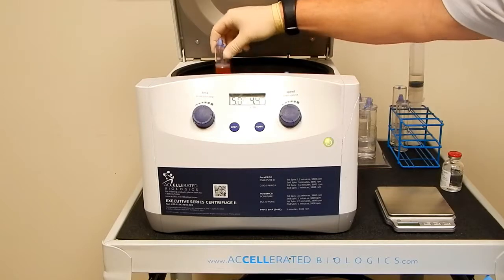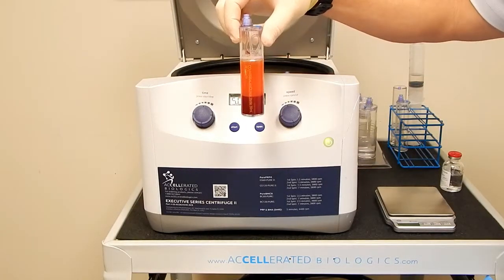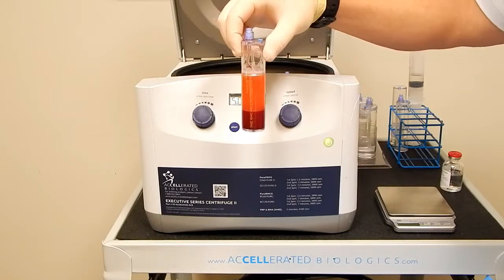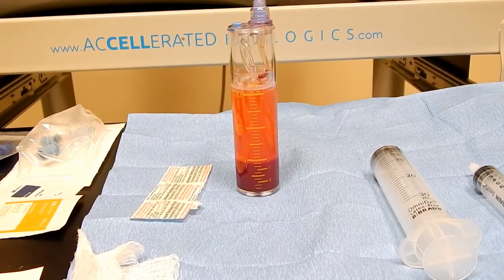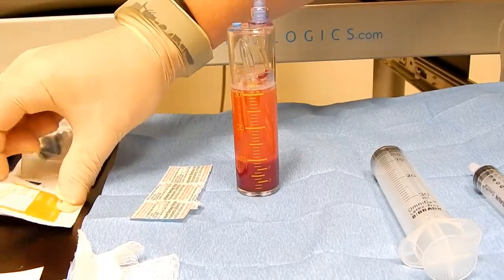As we take out our sample, we have great separation. We have our cellular buffy coat right on the red blood cell interface, which we will now obtain. Once the separation has occurred, we are going to aspirate out all of our excess plasma.